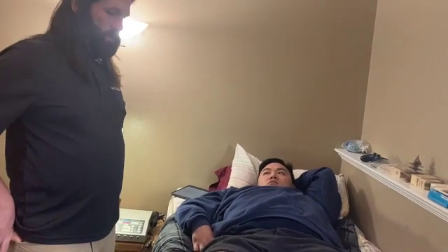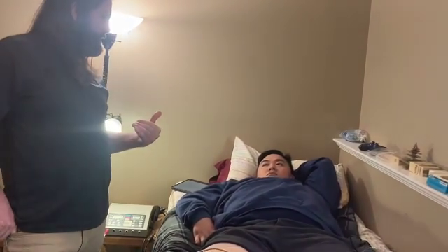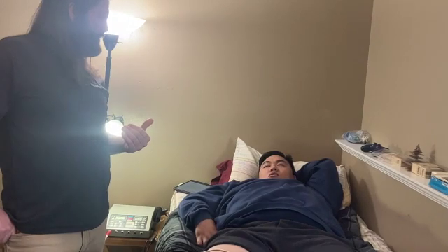So Kevin, how does it feel so far? Feels really good. So if you had to say what your pain number is now, compared to when you started, does it come down at all from your 5 out of 10? Currently, it's maybe like a 3 or a 4. A 3 or a 4. So it is coming down a little bit. Just a little. Yeah. And we would expect that as we went longer. It does feel better than my 5. Yeah. So we're trending in the right direction. We would expect that as the treatment continues and as that gating theory kind of builds up, you would get lower and lower pain numbers.